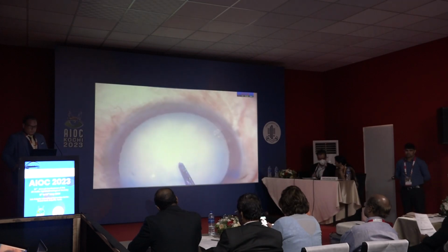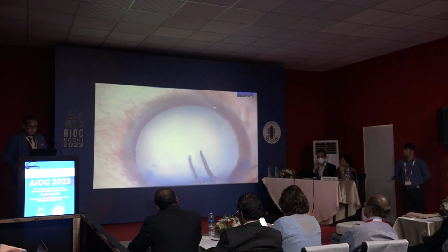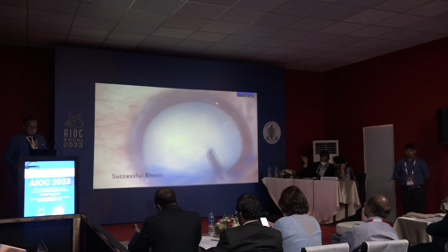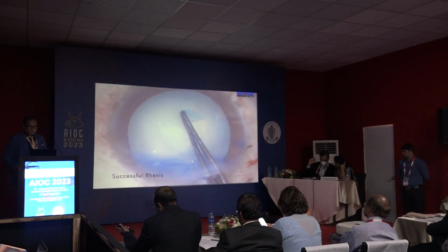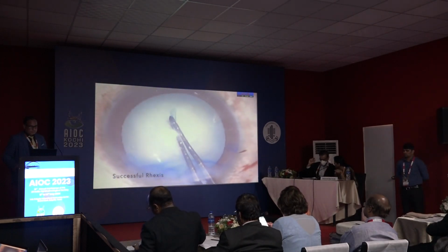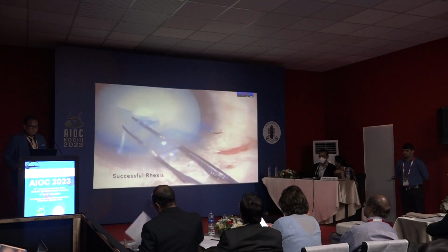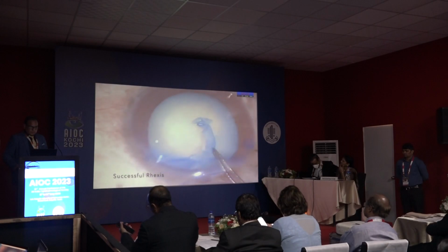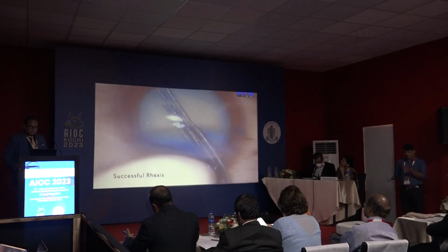Evacuation of the intralenticular fluid, including the posterior compartment fluid, is achieved by tapping the capsule posteriorly. Again, cohesive visco is pushed in the AC to flatten the anterior capsule, and the intended 5 to 5.5 mm capsulorhexis is initiated after tearing the central hole using a rhexis forceps and easily completed without the risk of peripheral extension.